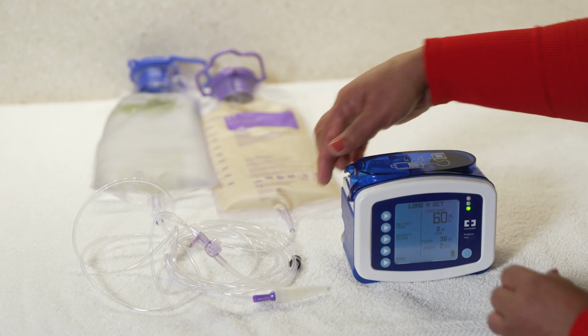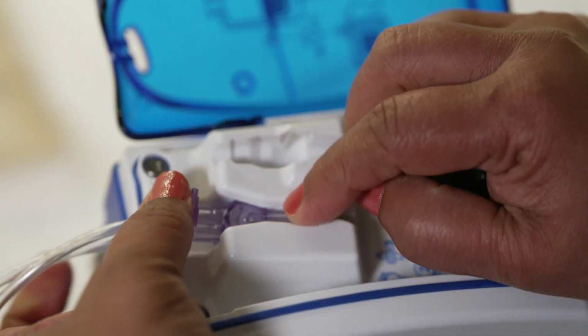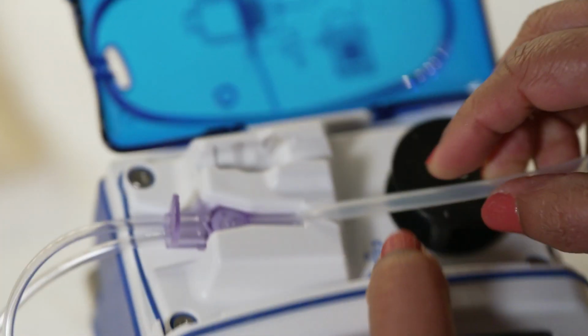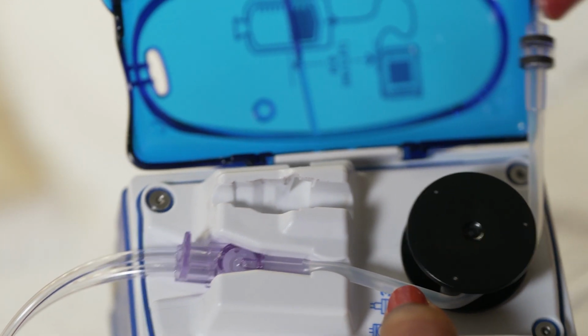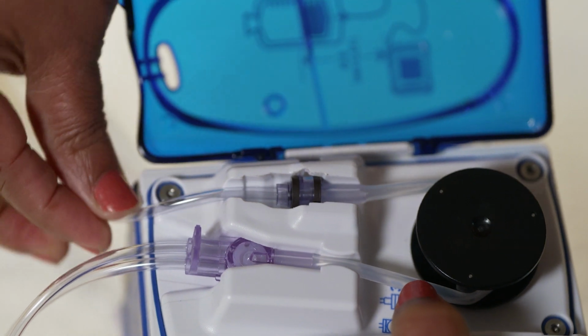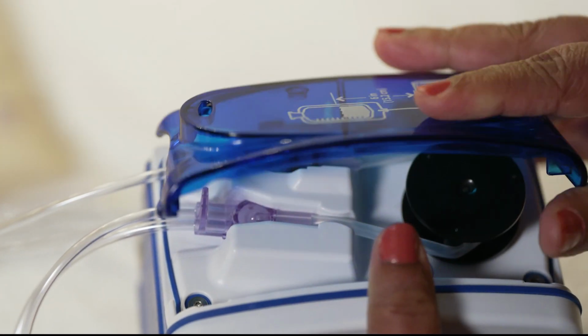To set the pump for feeding, open the door on the top of the pump. Slide the thumb tab on the valve into the slot on the left side. Make sure it is pressed down and firmly secured in the loading column. Hold the black retention disc and gently wrap the tube under the rotor and drop the disc into the slot on the right. Close the door.